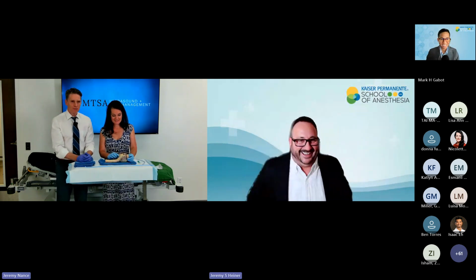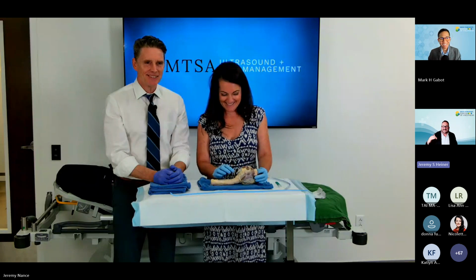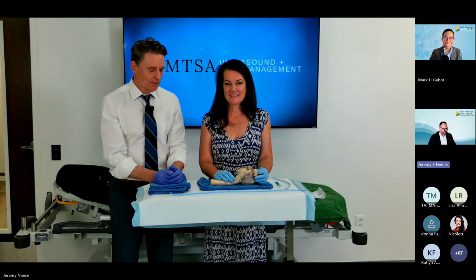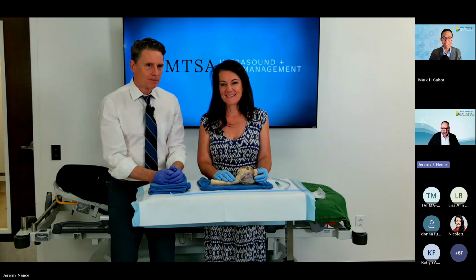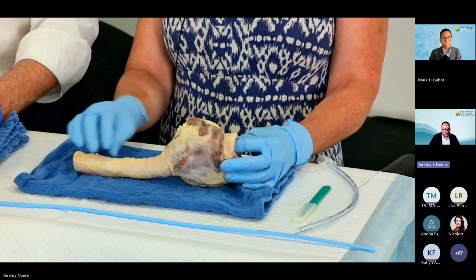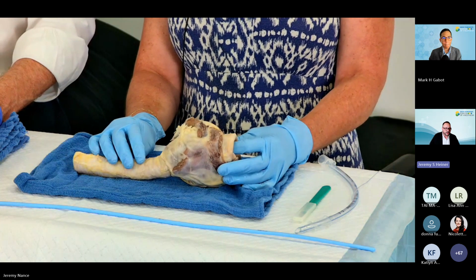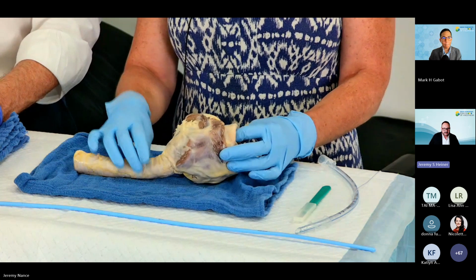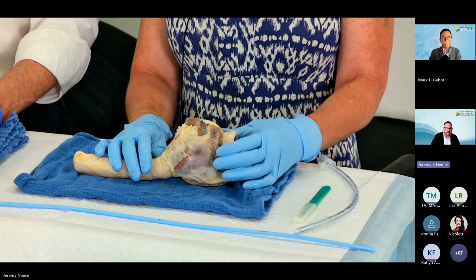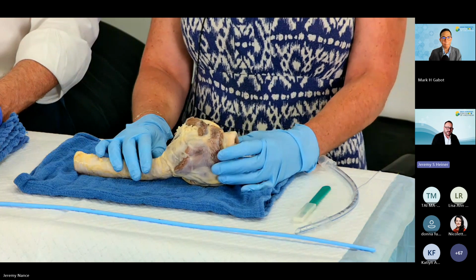Sorry, Jeremy. All right, you guys, this is my very first virtual cricothyrotomy in my entire life, so I'm excited about this. Okay, all right, so we see that Nicolette has a porcine model of pig trachea here, and if you'll notice, Nicolette, you're right-hand dominant, is that correct? I am. Okay, perfect. So she's standing on the correct side, at the right side of the patient.